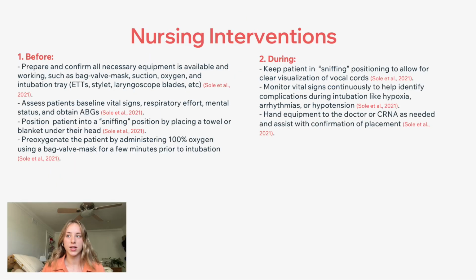Moving on to nursing interventions. So before ETT insertion, nurses need to prepare and confirm all necessary equipment is available and working, such as a bag valve mask, suction, oxygen, and intubation tray, which holds things like the ETT, stylets, laryngoscope blades, etc.